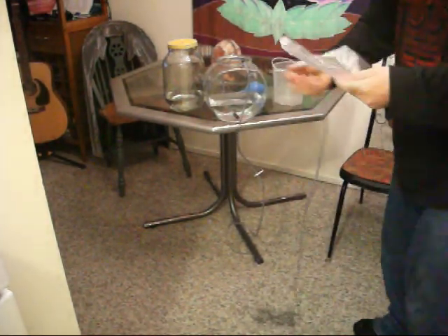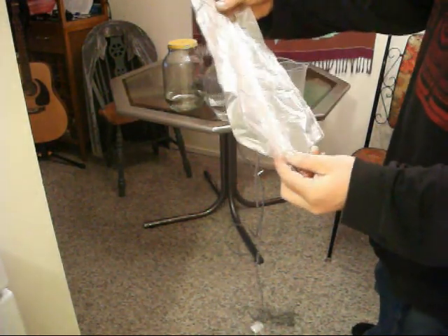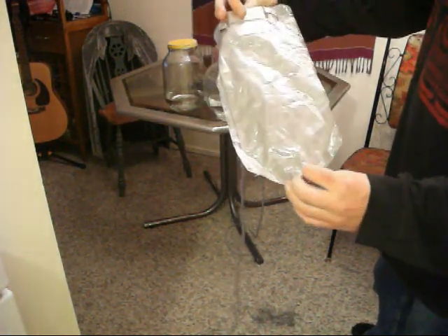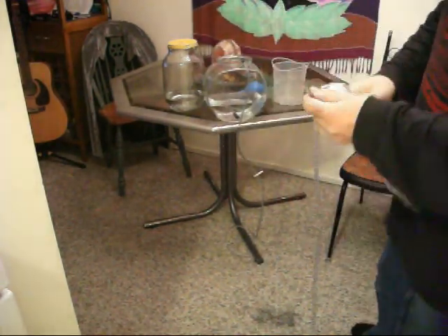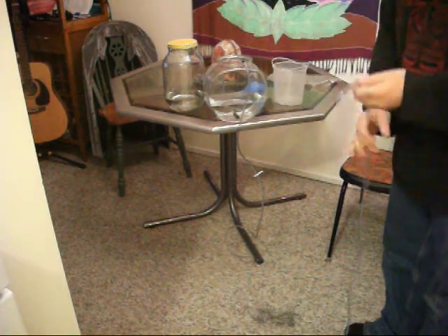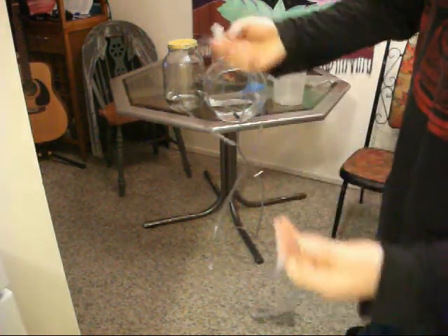And this version here, what you do is you buy one of these enema disposable bags, and they only cost between $5 and $10 depending on where you are in the world, but they're really cheap. And once you make one, it'll last forever because it's glass, as long as it doesn't break. And so it comes with the clip here to turn it on and off. It comes with the tube.